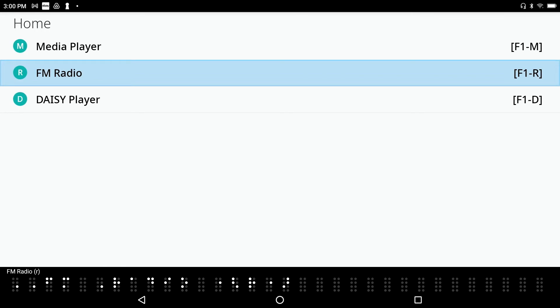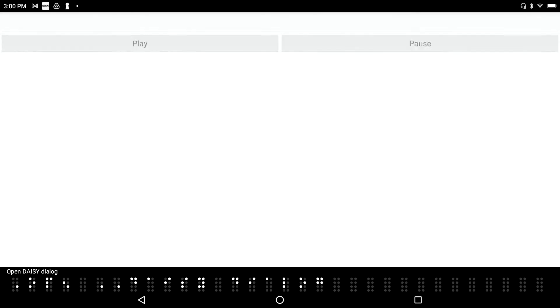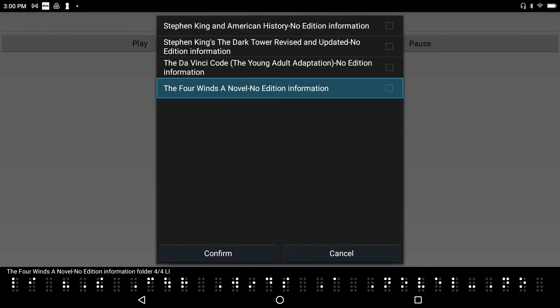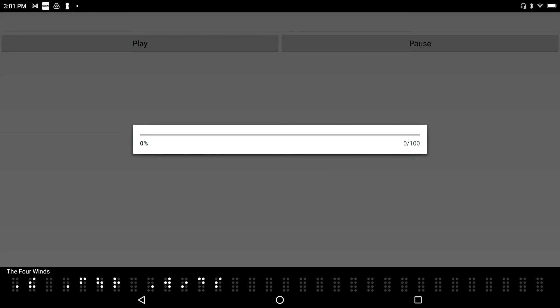I'm back at my media menu. And I'm going to go down to the DAISY player. DAISY player. Actually, why don't I go? Yeah, I'm going down to DAISY player. I'm going to press Enter on this. Open DAISY dialog. The Four Winds, a novel, no edition information, folder 4. And, yes, I am actually already set to DAISY mode. That little three-position switch at the front, just to the left of the multimedia buttons there. There's three positions. The middle one is DAISY. And I'm going to go ahead and select the book that I'm on right now. Selected the Four Winds, a novel, no edition information, folder 4. Call this Four Winds, and I'm going to press Enter to open it and begin reading.